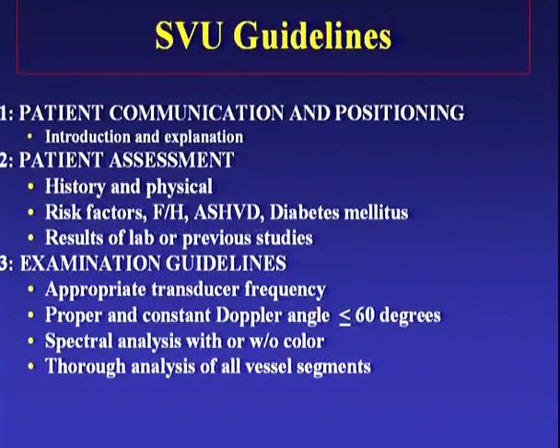The guidelines themselves, as I said, are divided into seven sections. The first section is patient communication and positioning. It's very important at this section of the examination that you explain what you're doing, tell the patient that you are going to scan the upper extremity, and that you may need to move them in certain areas during the examination. Ultrasound is not going to hurt them at all, so they should be fairly comfortable, and throughout the examination, you will continually explain to them what you are doing.